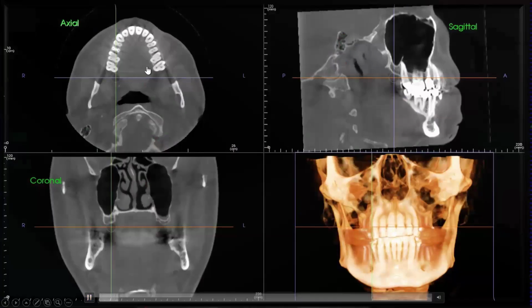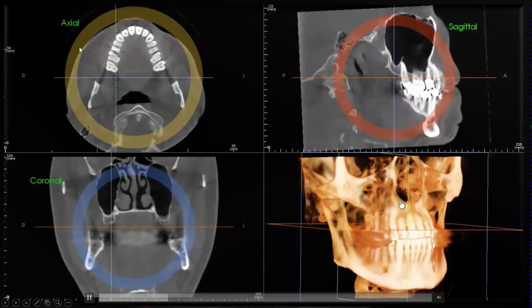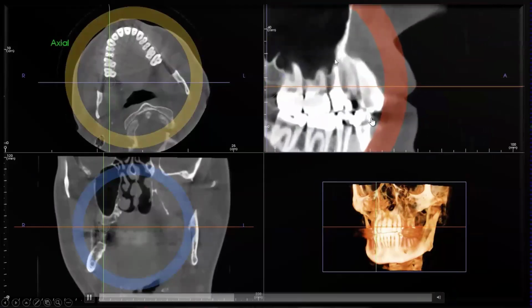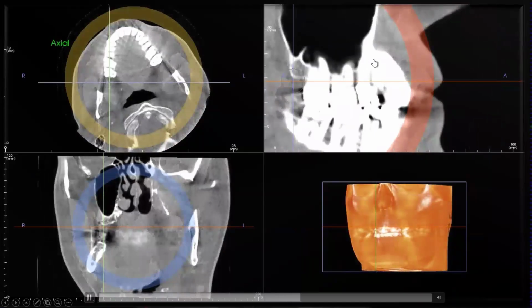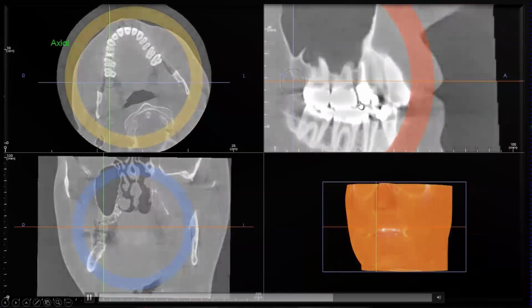Axial slice up here, so like a horizontal one, sagittal from the side, and then from the front is coronal. You saw me move, kind of drag around the 3D image. Here now I'm changing the orientation so it aligns with the right side of the arch, if I wanted a better look at those teeth. And then a little bit I was zooming in and out, so kind of going buccal and lingually. Now I'm changing the contrast, brightness. And I think I do a little bit of measurement here at the end.